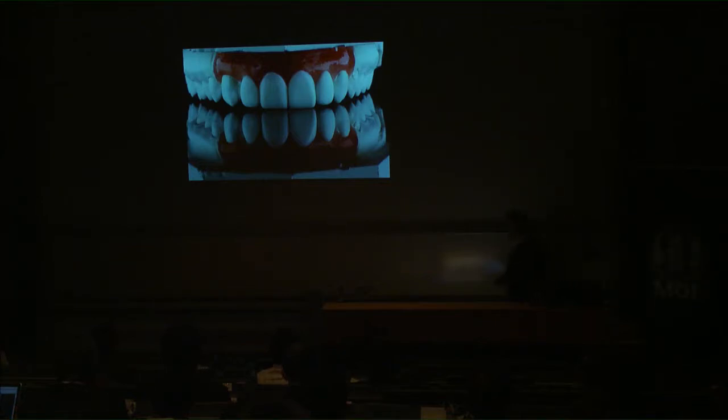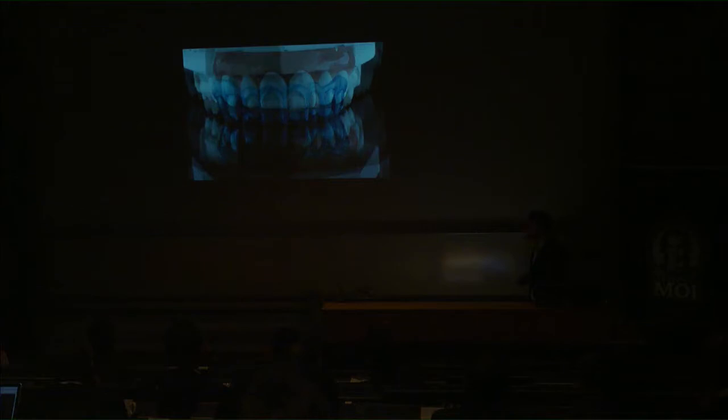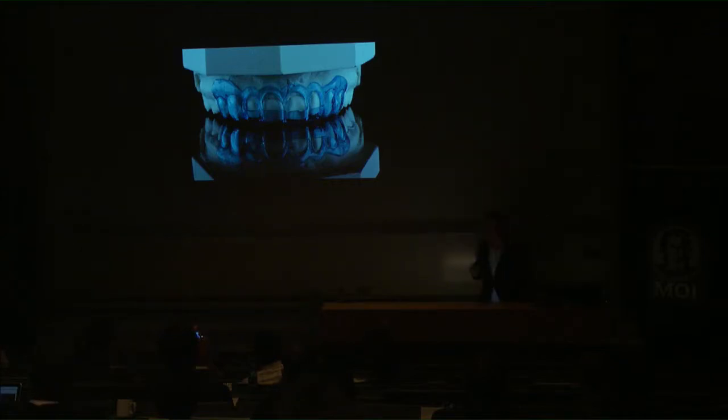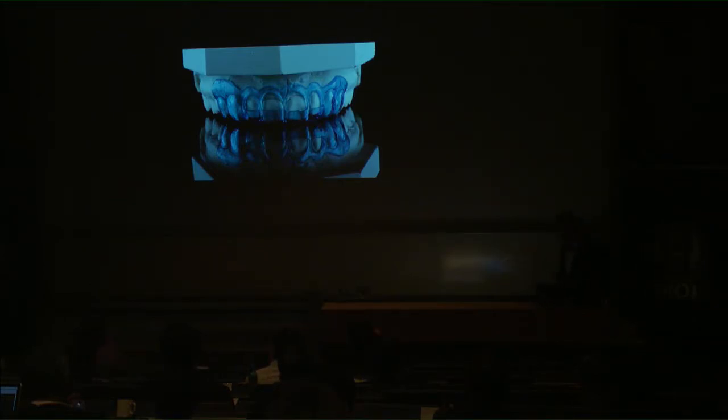Then we give this information tooth by tooth to our dental technician, who makes a wax-up. Then he makes a surgical guide for us. These days, of course, everything is sent digitally, and then he designs the guide for me, and it's printed in my Formlabs printer in my office.